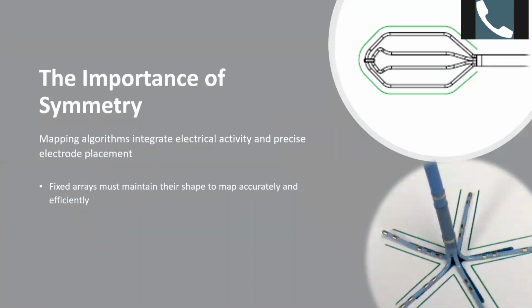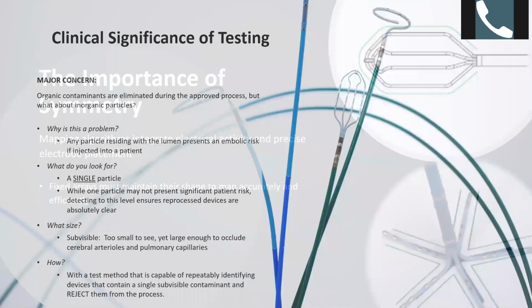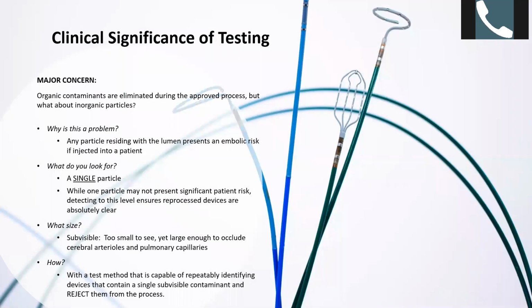But what about things that you can't see? Our processes must meet conservative FDA Tier 3 cleaning endpoints, along with sterility, biocompatibility, and other testing. But previously, there was no guidance on including particulates found within a lumen. Prevailing thought was that these would be discovered through the many tests assessing residual levels of hemoglobin, protein, or total organic carbon. And it is accepted that passing these tests proves the process fully removes such contaminants.